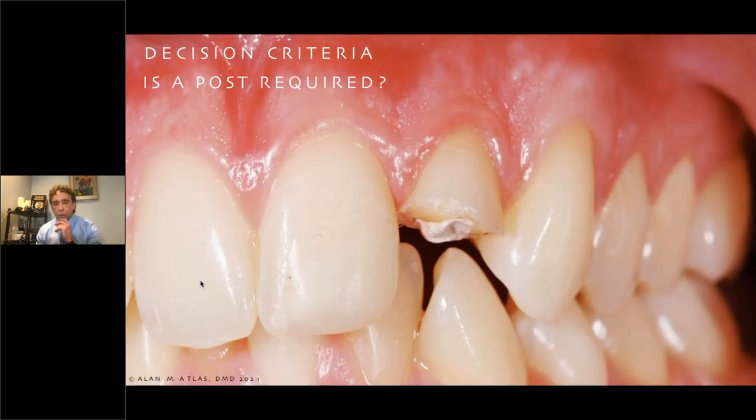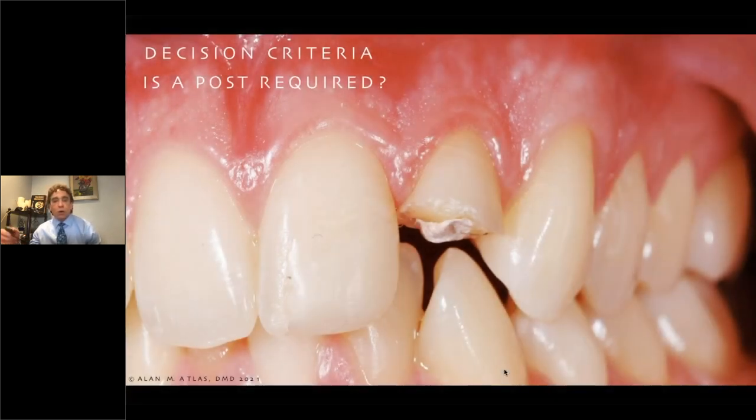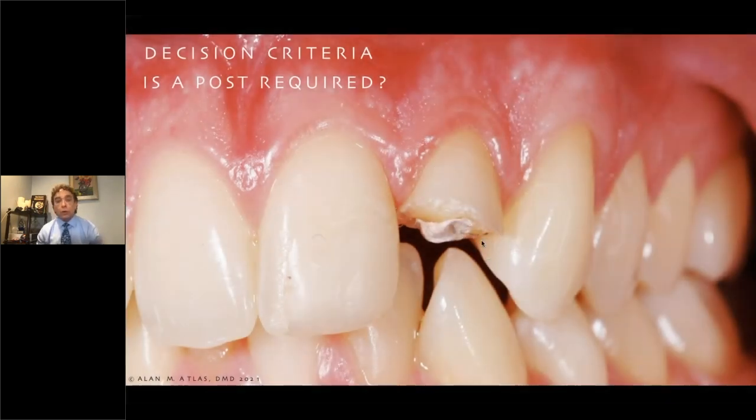And this is going to be our criteria. You look at this patient who had a fractured tooth. This patient came to me. You can see there's craze lines in the enamel, a deep overbite, but this is the offending tooth. This tooth is the killer tooth. I look at this tooth and it's a monster. This caused a massive fracture to this tooth. So I have to do something about this, because if I just put a core buildup here and do a crown, it's going to happen again. And I don't want to prove Einstein's theory of insanity over and over again. I want to change the way I do things. So I have to mellow this tooth out, but I have to figure out how I'm going to reconstruct this tooth so it doesn't happen again. That's the goal. So this is my criteria.